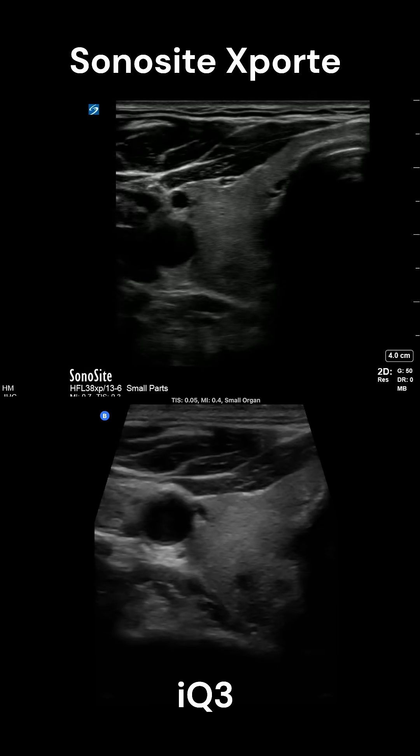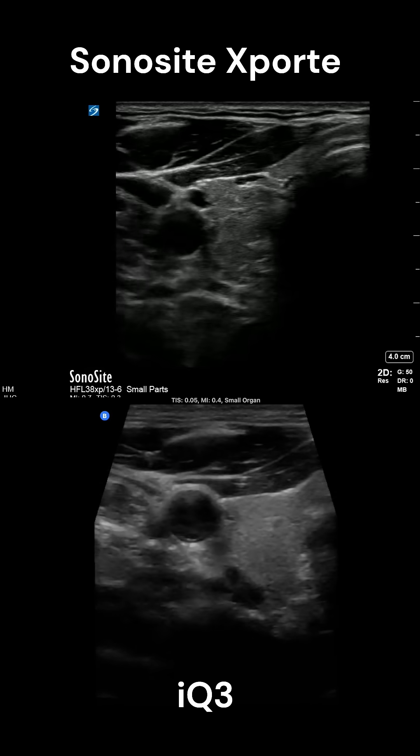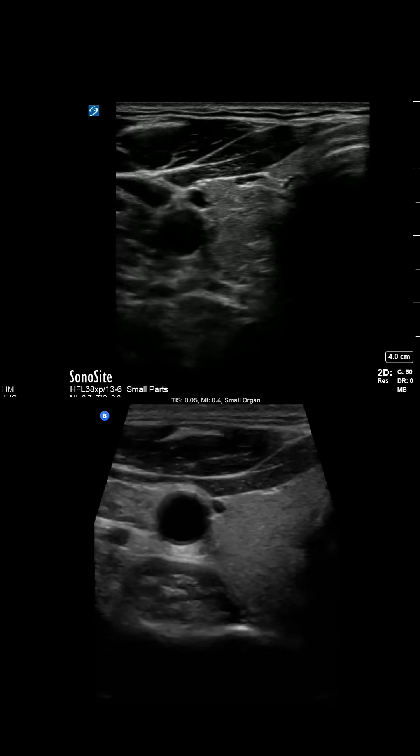And here's the thyroid image again. I looked at this over and over because I didn't want to believe it, but I think the IQ3 is even slightly better than an expensive cart-based machine.